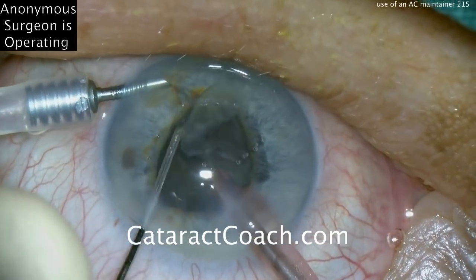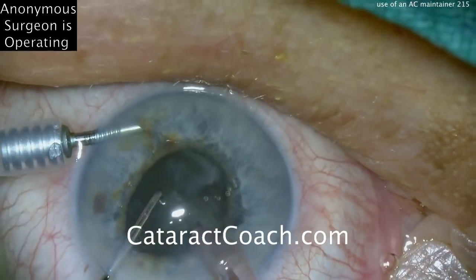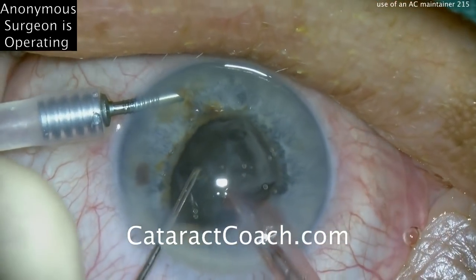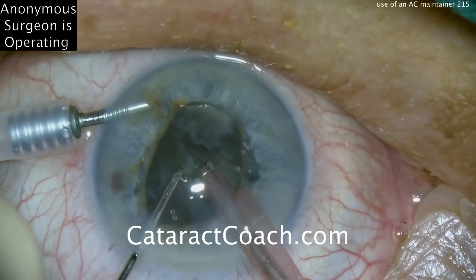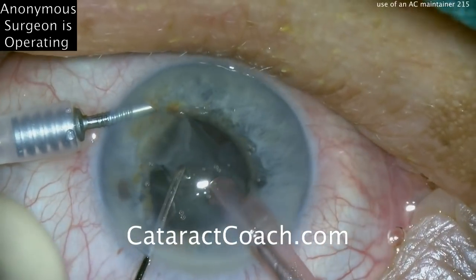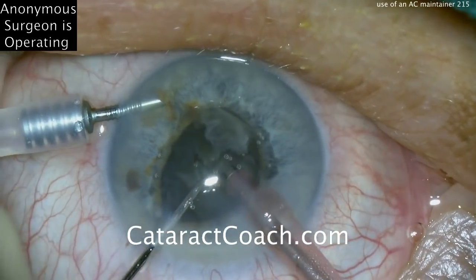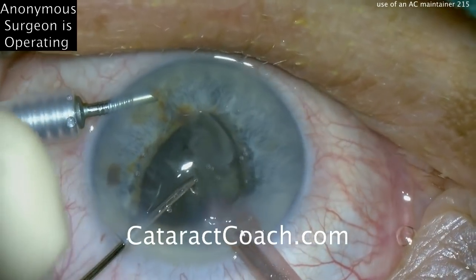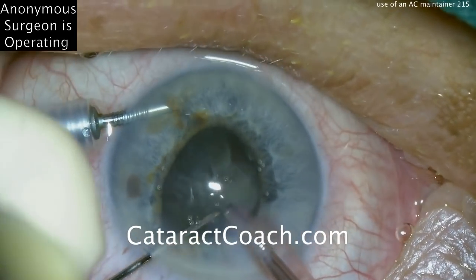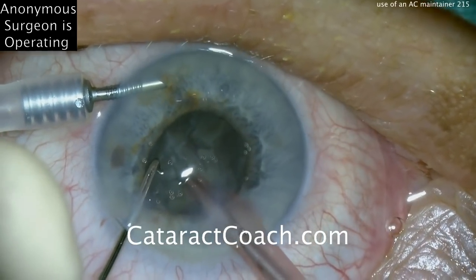In general, you want a little bit more than one millimeter — this is probably even half a millimeter. One to one-and-a-half millimeters is about ideal. Buzzing into the nucleus a little bit more — that looks great. Another sub-chop, and then we'll remove these pieces. The pupil is coming down, so it's very important to stay in the center of the pupil like this surgeon is doing. Great use of the left hand to get the pieces in front of the phaco probe. Important that you don't allow the pieces to sit under the phaco probe — you want them in front of it.